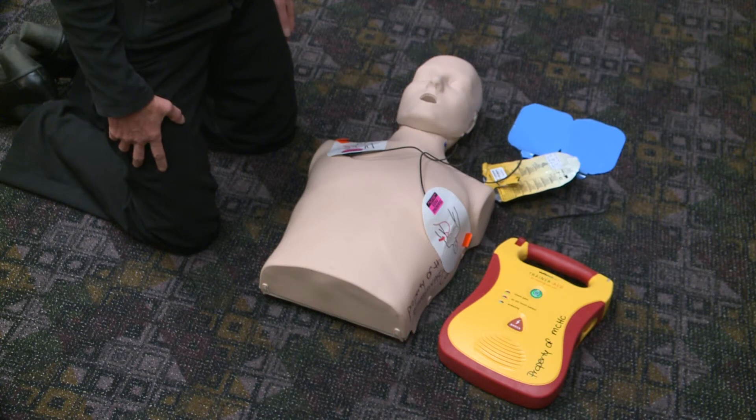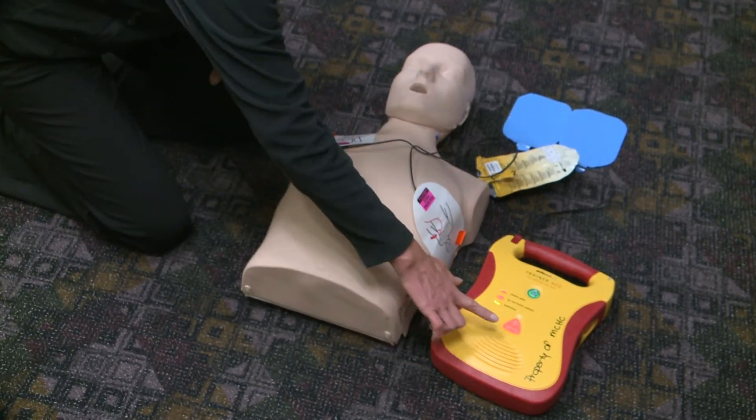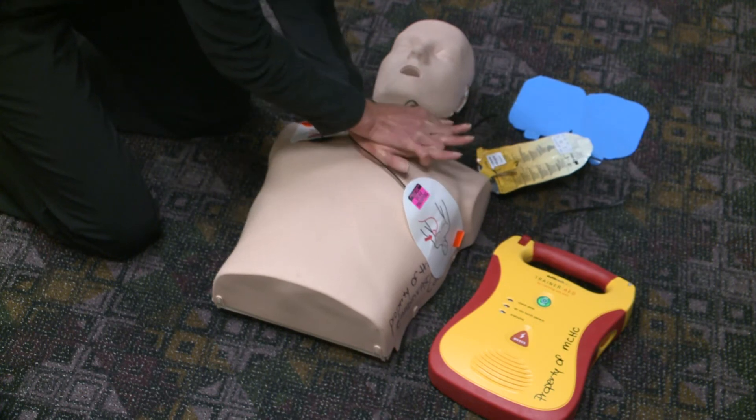Shock advised. Charging. Stand clear. Press the flashing shock button. Shock 1 delivered. It is safe to touch the patient. Begin CPR now.